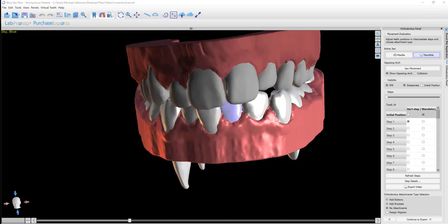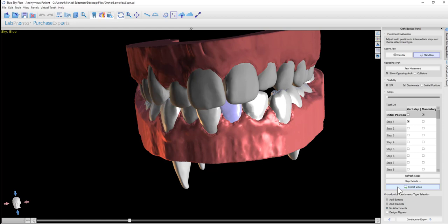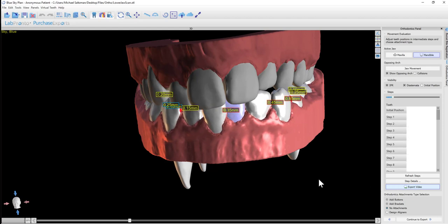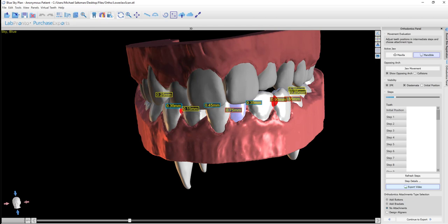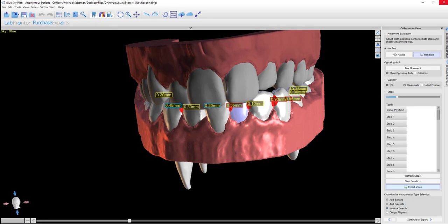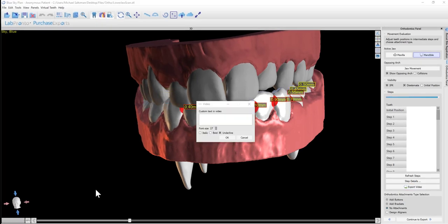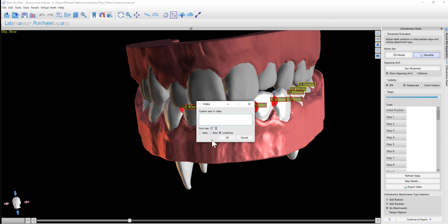We have also added in a feature to export a video of the tooth movements. So if you click on the export video button, then the software will run through and process the different steps, and then it will bring up the ability to add in custom text onto the video. So if you don't want custom text, you could just click OK.